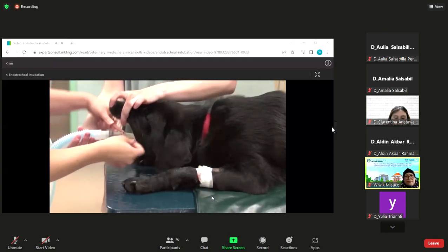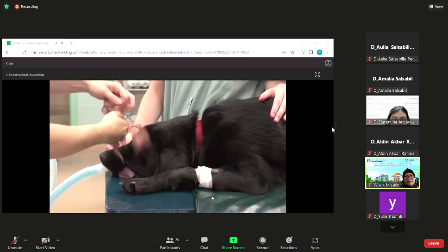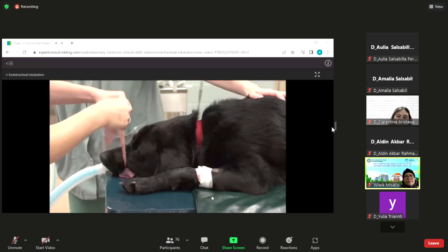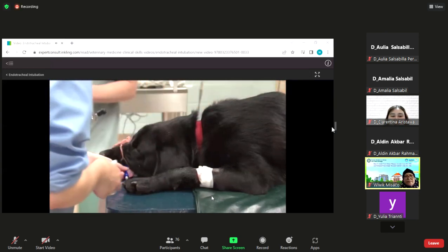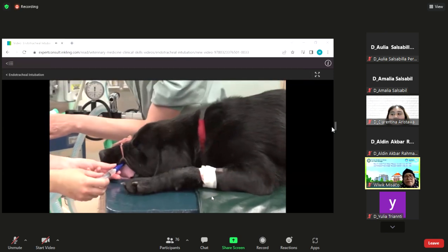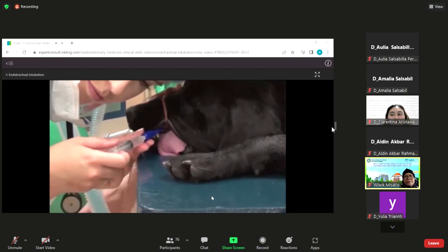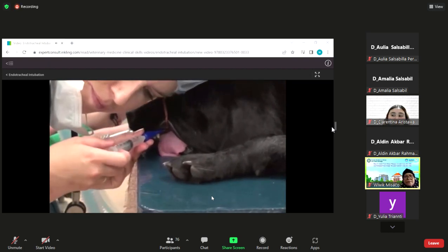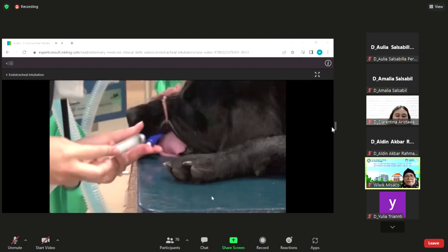Fasten the tube around the maxilla in dolichocephalic and mesaticephalic dogs, as we see here, or caudal to the ears in cats and brachycephalic dogs. Inflate the cuff to a pressure that creates a seal, which you can check by having the assistant close the pop-off valve and give positive pressure ventilations for a few seconds, while you listen for air leakage and adjust the pressure of the cuff as needed. Remember to open the pop-off valve immediately afterwards.